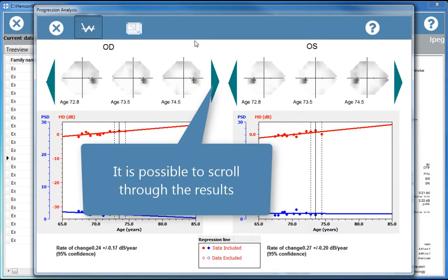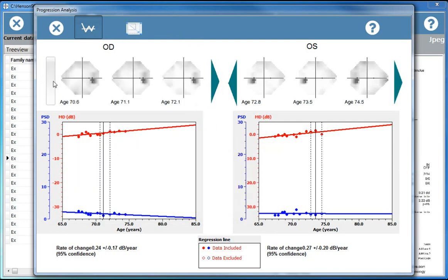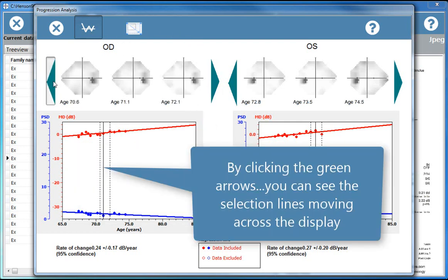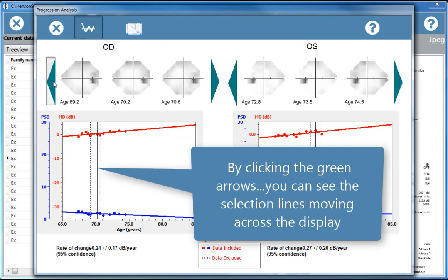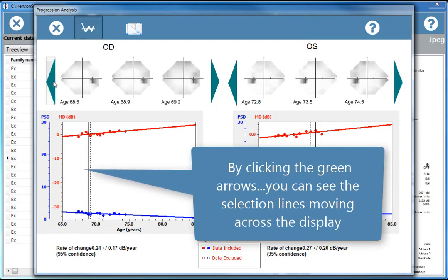It is also possible to scroll through the results. By clicking the green arrows, you can see the selection lines moving across the display.